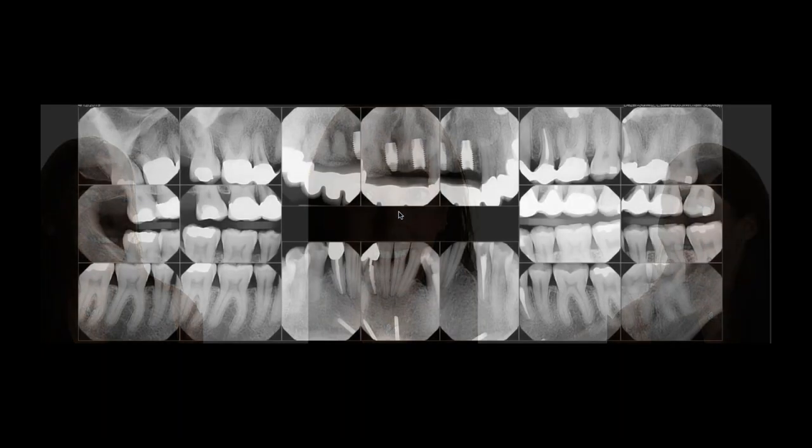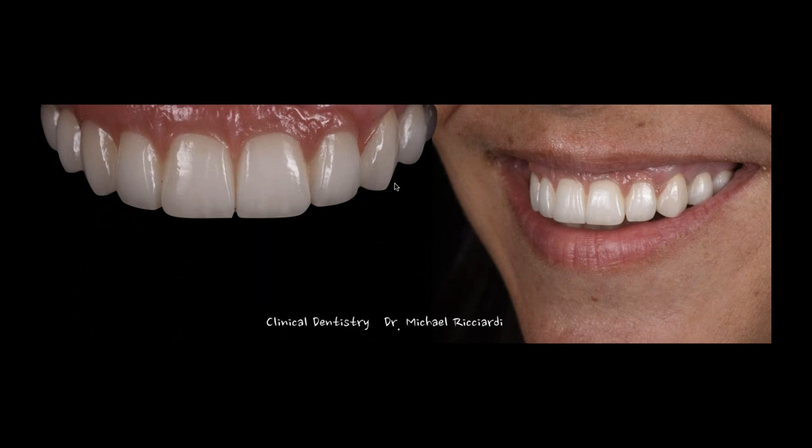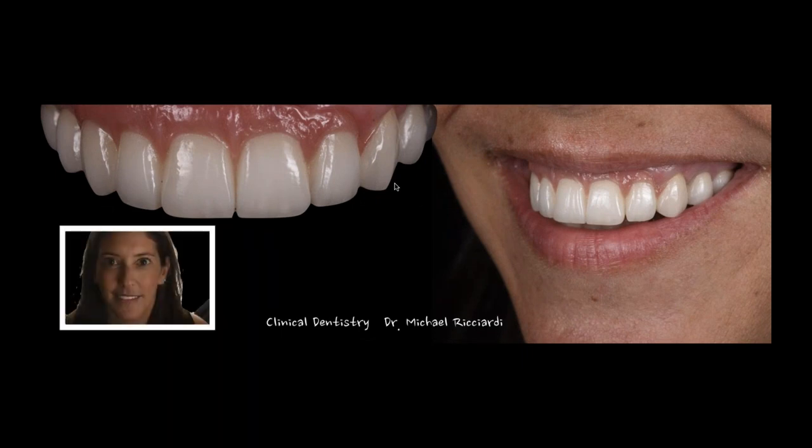So whether your cases are simple single veneer type cases, or combination cases, or full mouth cases, or implant involved cases, they all work. And by the way, you'll notice that we put those implants to sleep and actually went in there and ground them down a little bit so they were really out of our way, and we can utilize whatever was left of our tissue to make it a little bit more aesthetic for us across the board. So there's Esty's final.